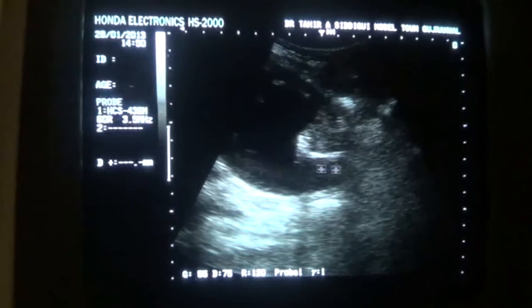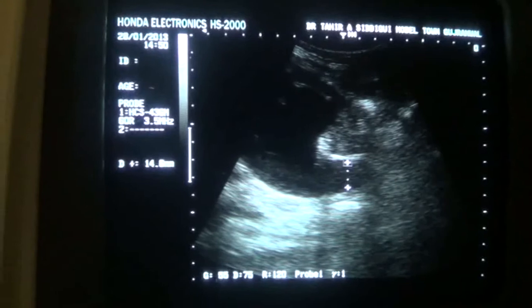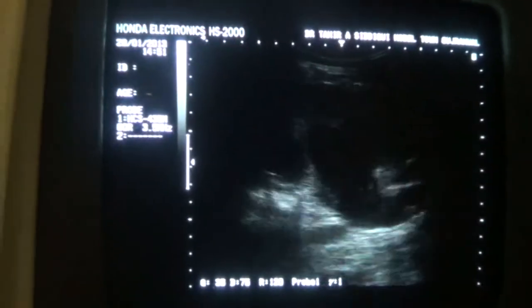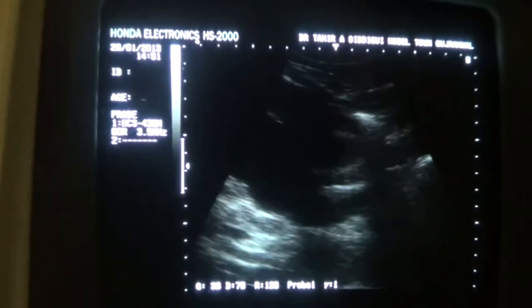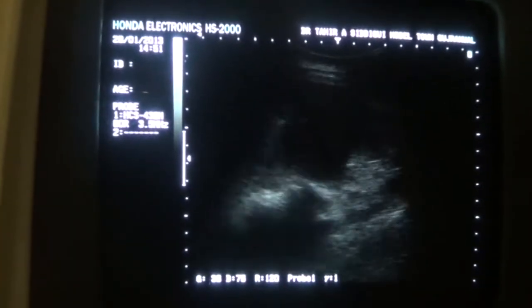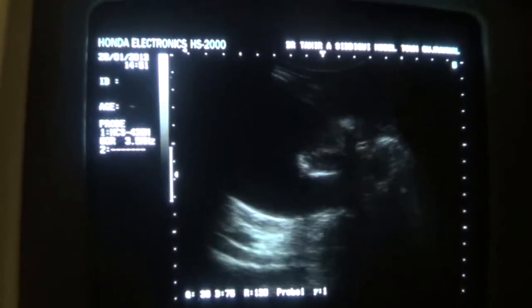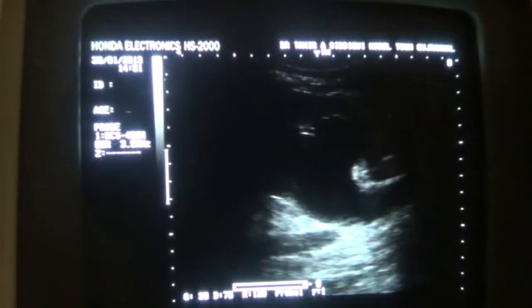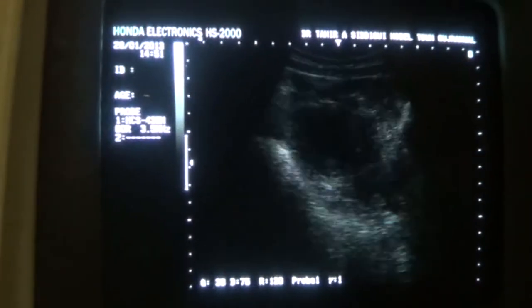Here you can see that the ureter is dilated. This is the proximal ureter measuring 14.5 millimeters. Normal should not exceed 7 millimeters. So this is a dilated proximal ureter. It can be traced up to this level only. No calculus is visualized in this study, so the level of obstruction cannot be reached.